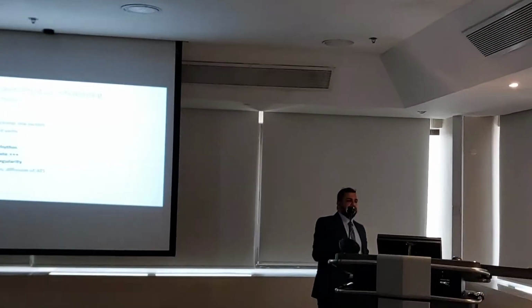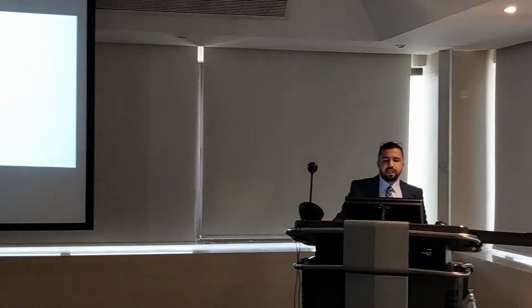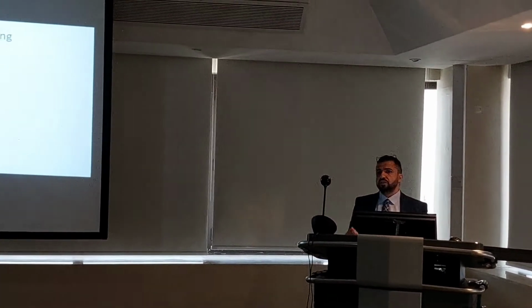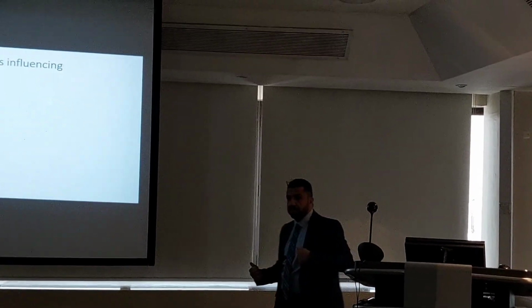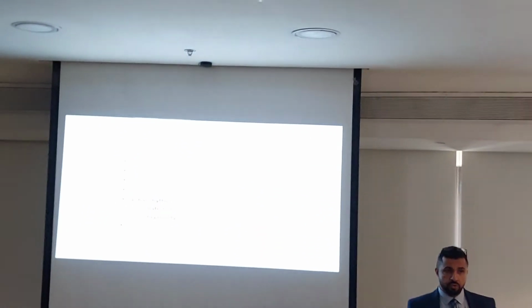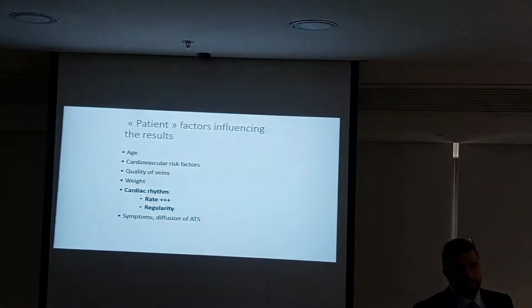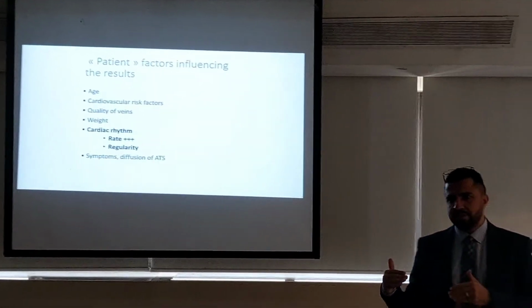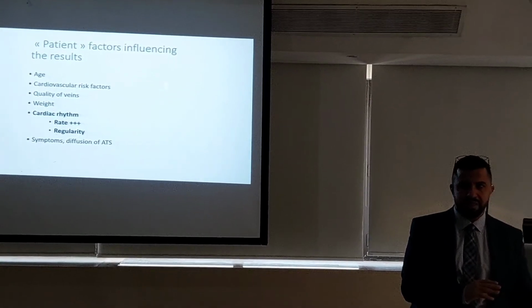The cardiovascular risk factors, the quality of the veins as well. This is affecting the weight of the patient. If I have a more obese patient, usually the doctors speak with the department, especially for cardiac, and they will limit the BMI. Within a certain limit I will be able to do it. More than that I will not be able to do it.